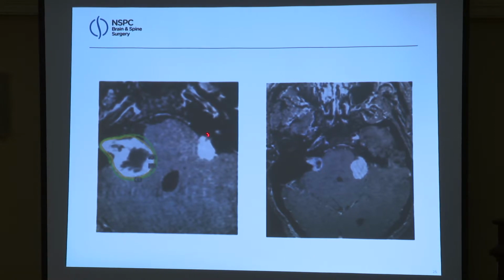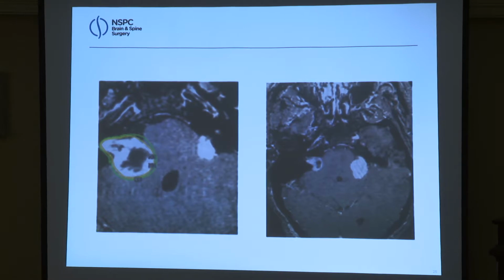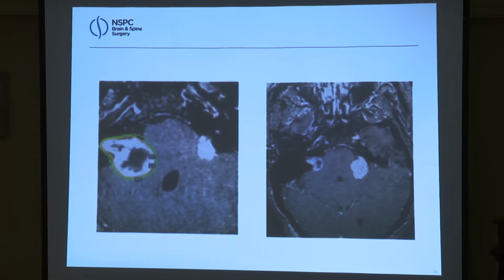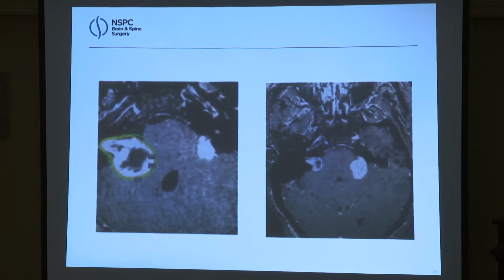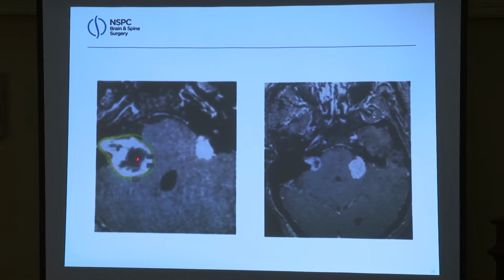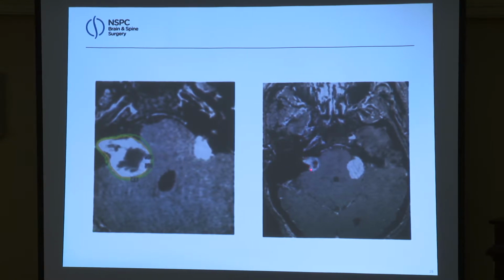There's another patient that I treated, a patient with neurofibromatosis type 2. Most of the patients we see are just single acoustics. There's no genetic or family predisposition. In rare cases, we'll see people with NF2. These are a little more complicated because obviously if you lose hearing in both ears, you've got a devastating problem. She presented with some headache, she had 80% loss of hearing in this ear. We treated this tumor, and several years later the tumor is almost completely gone, and her hearing is almost back to normal in this ear.